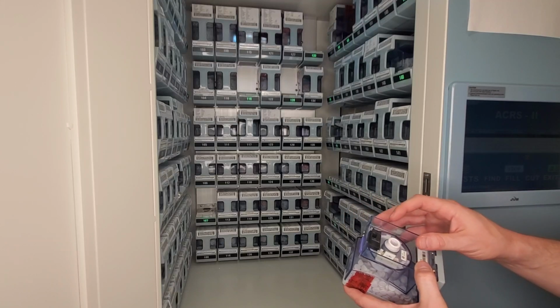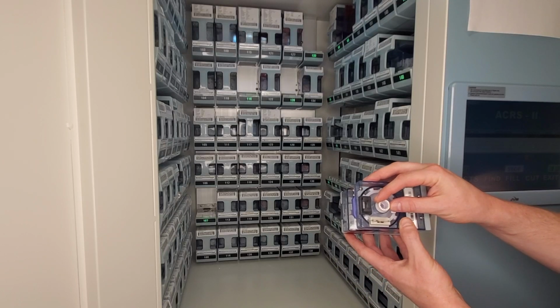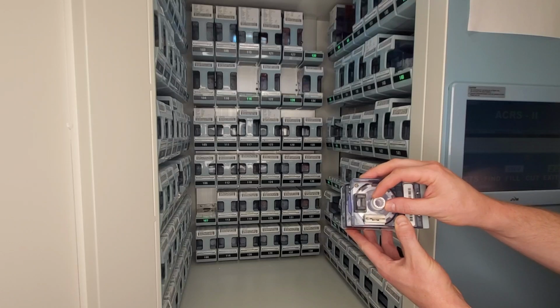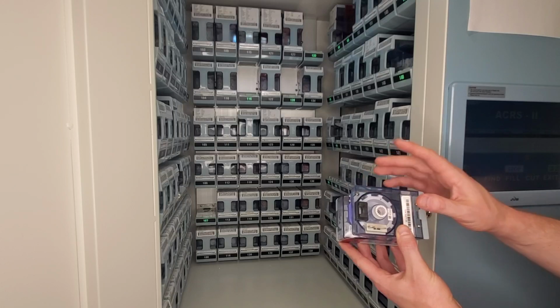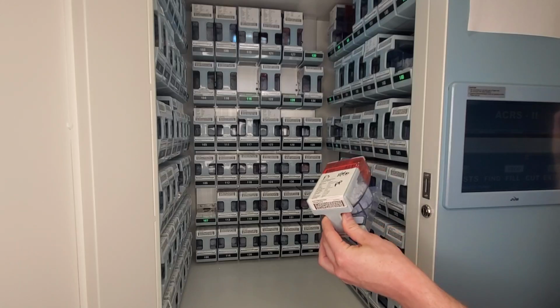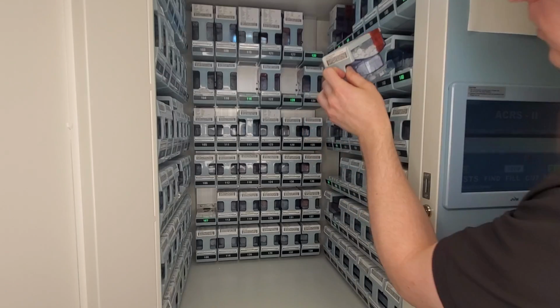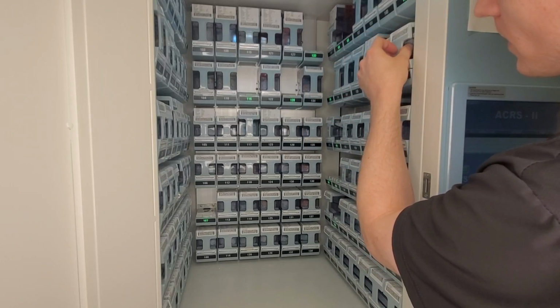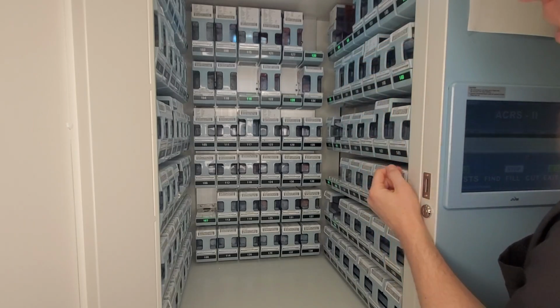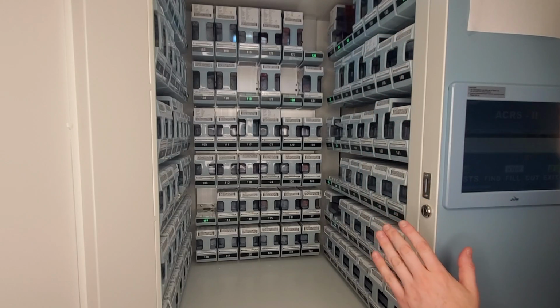Now, one thing to know about putting the canister back is you need to make sure that you close the hole. This is an open hole of the canister. This is a closed hole of the canister. The second thing you need to do is put it back in its base, but preferably a different one. So if I put it in 140 right here, I want to place it gently back on, and when I let it go, the light should go out. If I did not put it in correctly, the light will not disappear. So once it's in there correctly, the light disappears.